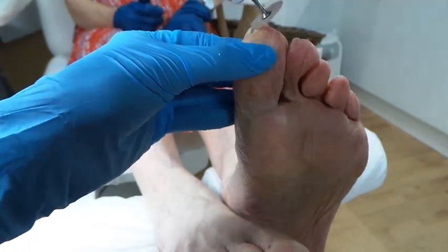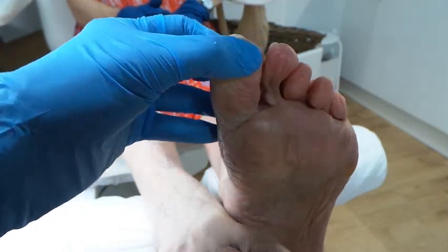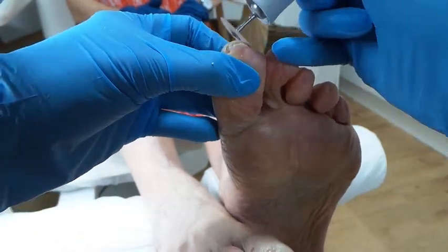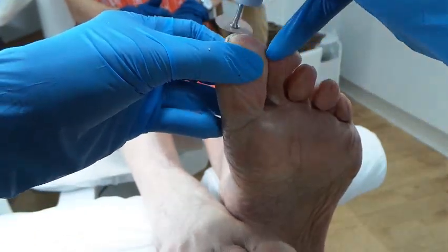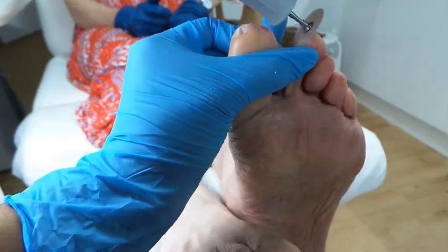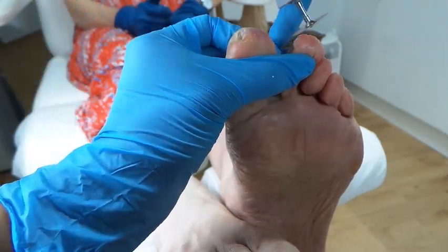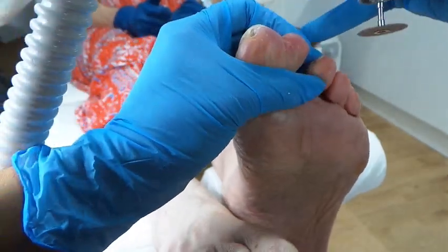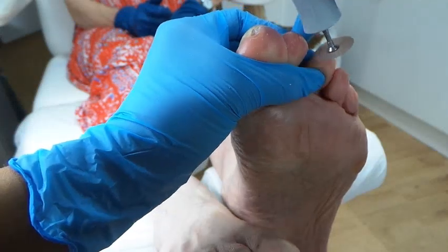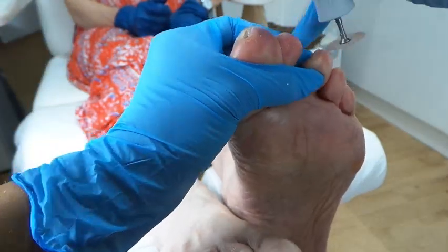When you do it flat like that, it's okay. But as I've explained, if you catch it, it can be a bit uncomfortable. I'm using my little finger as an anchor on my other hand just so I'm steady, and then anchoring my hand and bringing it down and then across the nail.